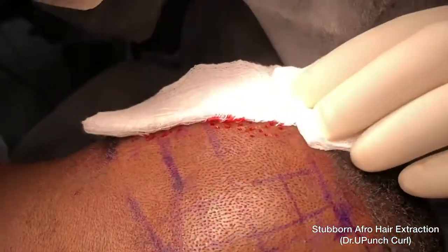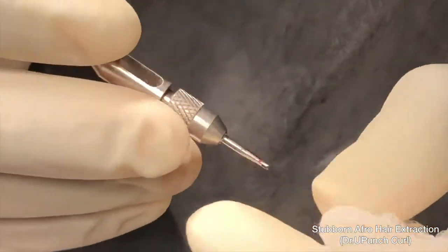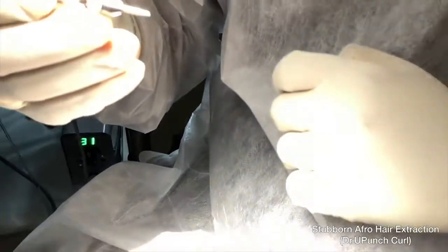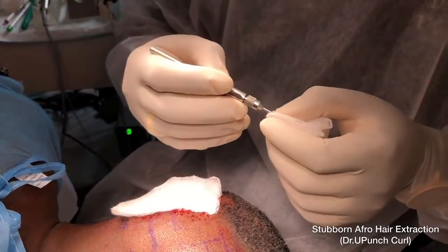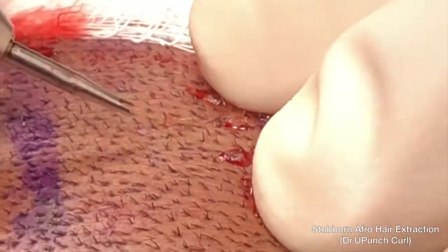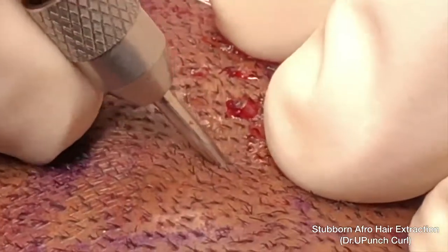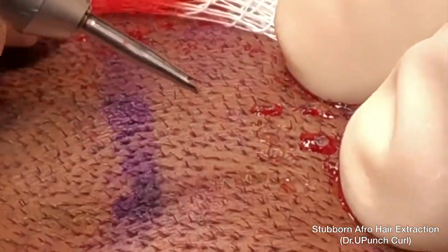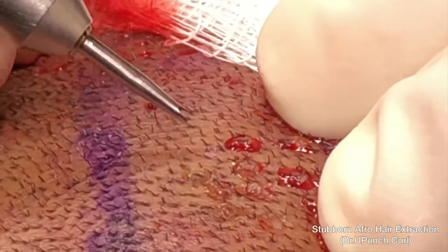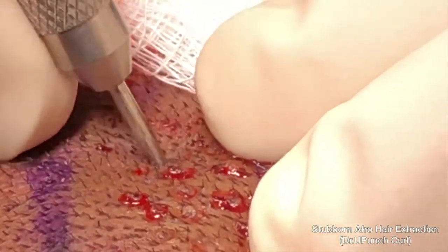The new Dr. U Punch Curl 2.0 is the final, latest edition of the Dr. U Graft Revolution with a manual punch. We've made critical changes to it to allow the extraction of all afro-textured hair using smaller punches with minimum effort. This punch goes in quite easily; it is quite sharp, and yet produces fewer transections. This punch is completely manual and succeeds in cases that normally would have failed with conventional FUE techniques.